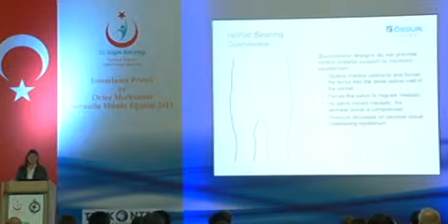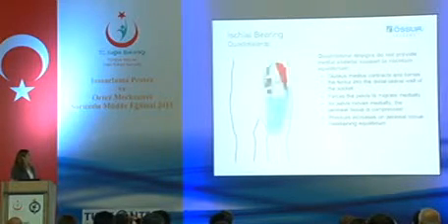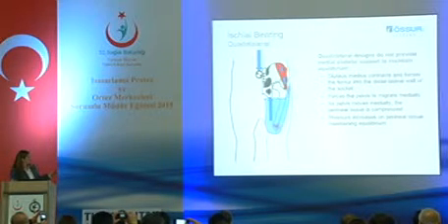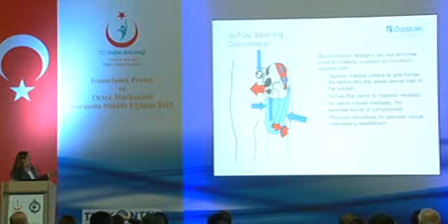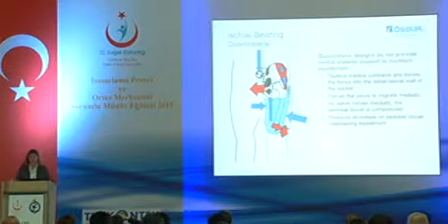So what does this mean? The gluteus medius contracts and forces the femur into the distal lateral wall of the socket. So we have that shift of the femur hitting the end of the socket, which forces the pelvis to migrate medially. And as that happens, the perineal tissue is compressed, and here we start to get pressure, which maintains the equilibrium.